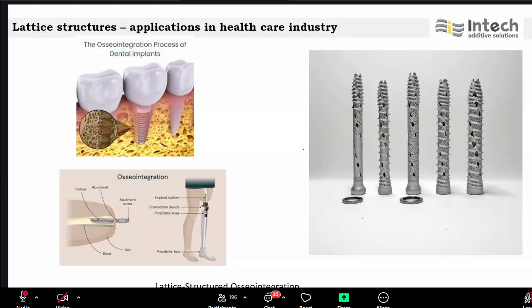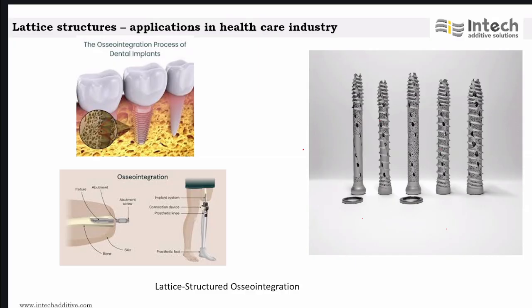And we have the bone integration, like bone growing onto the surface, which is very critical for the integration to happen. On the right hand side, you can see that there are five different screw designs, and different lattice patterns have been used, like stud-based and TPMS.